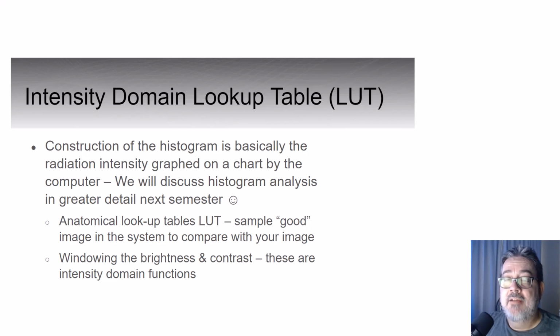Also, your radiographs are legal documents. So imagine a hypothetical situation here. Your patient sues the hospital and surgeon for malpractice due to complications from their cervical spine surgery. When your beautiful-looking swimmer's view gets displayed as evidence in court, they question your competence because the information in the DICOM header shows you processed it as a hip. And they ask if you know the difference between a hip and a spine. All images should be processed with the appropriate algorithm per the anatomy that you're x-raying.